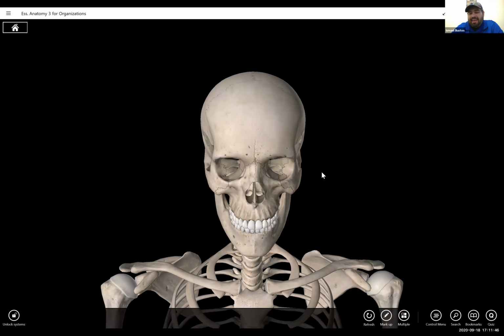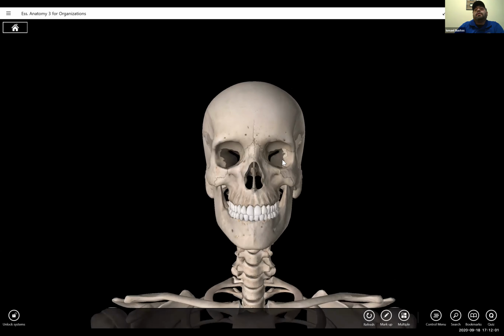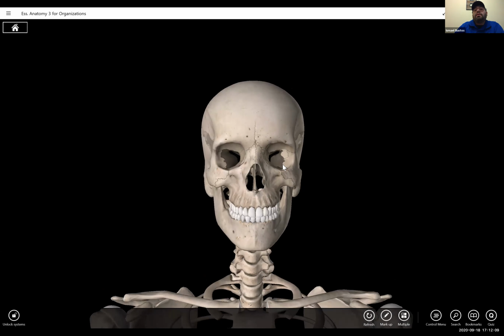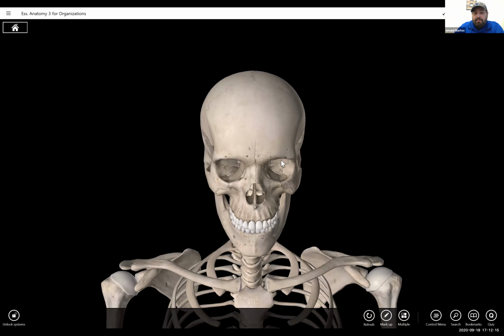What happens to my head? My head starts flexing, all right? So if I start flexing my head, my ridges start filling the entire orbit. If I extend my head, they start going below, because they're supposed to be here with the OML perpendicular. If I extend my head, then the ridges go below. If I flex my head more, then I get them inside the entire orbit.